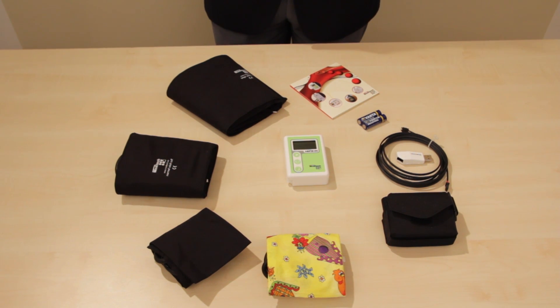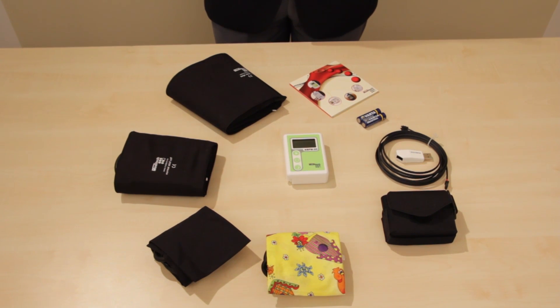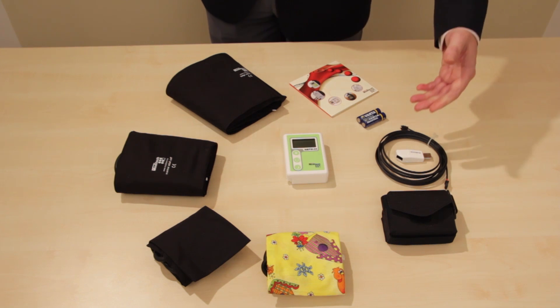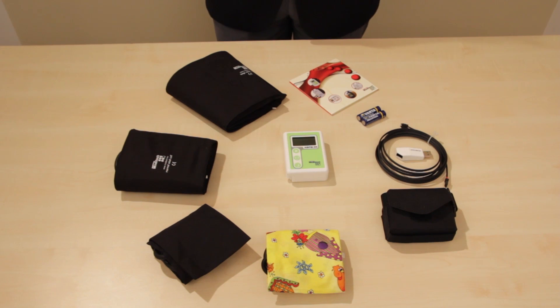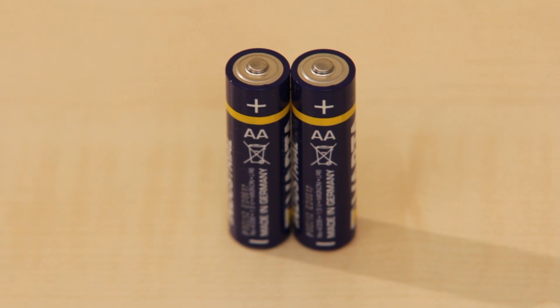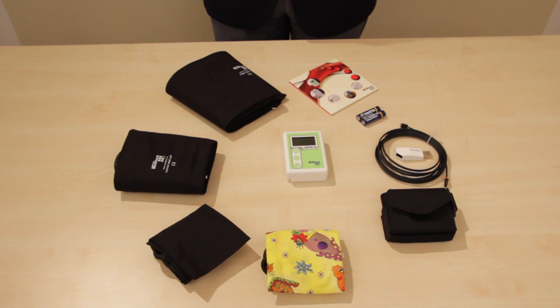The device can be programmed without a computer, but its primary use is connecting it to a Windows-based personal computer using a USB optical cable connection. The device operates with two AA size, either rechargeable or alkaline batteries. The package also includes a CD with the user software that you can install on the computer.